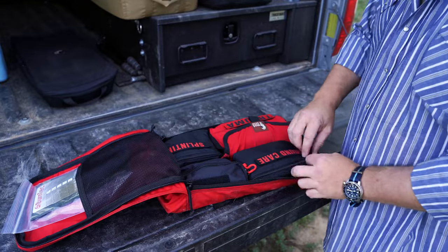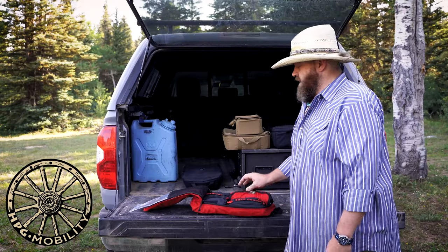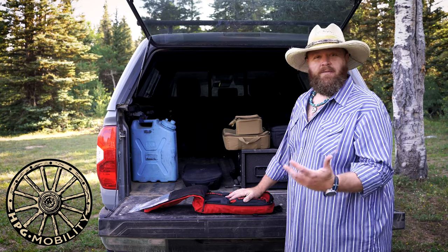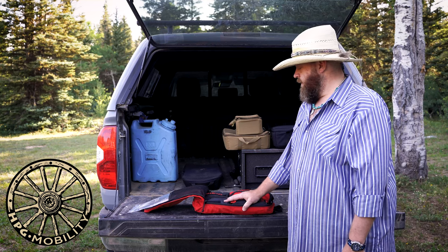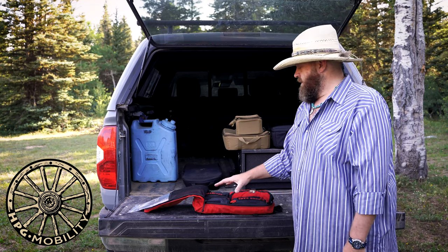Now is this a kit that includes stuff like IVs and that kind of thing? No. If you feel the need to plus it up you certainly can, but our goal was to just provide a nice, simple, straightforward, well-rounded kit.